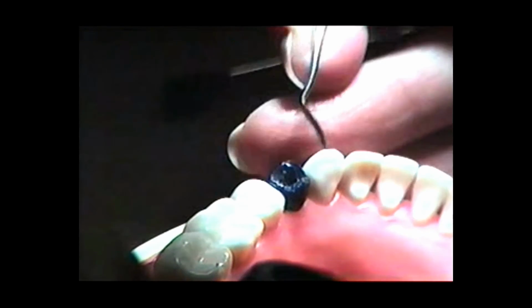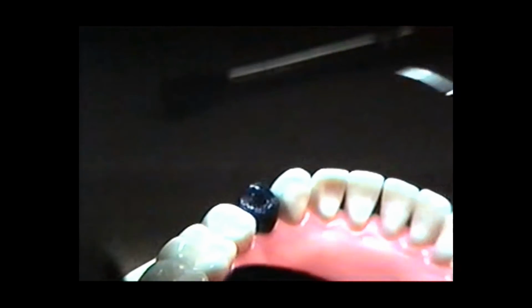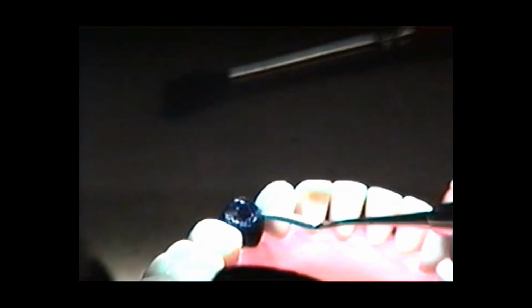This is the point where it's kind of fun and I like to fiddle with it some more, but right now we're going to stop and check the occlusion and see. I'd probably recommend that you do that before you spend too much time fiddling with your anatomy. So let's see what we've got here for occlusal contacts.